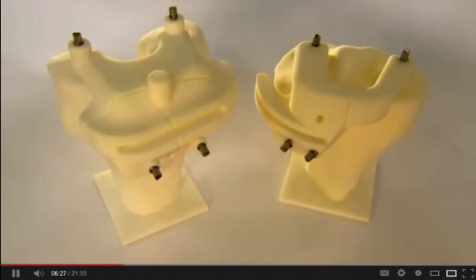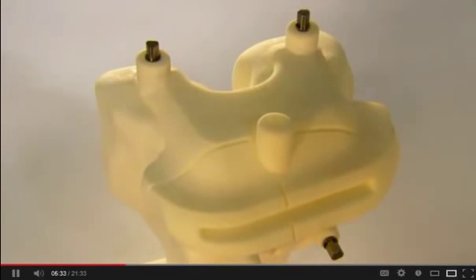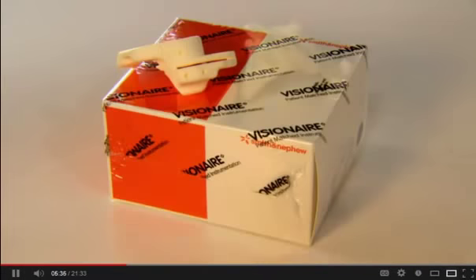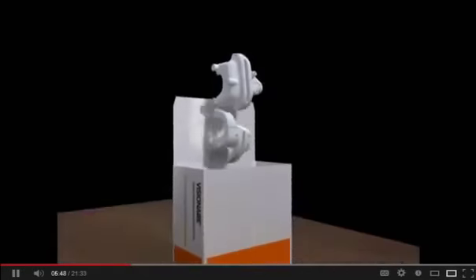This method eliminates several steps required in standard surgery. The operation takes less time and requires half as many instruments to set up and clean up. And because the surgeon no longer has to drill a hole in the bone to check the knee implant's alignment, the patient experiences less pain and bleeding, and a smaller chance of developing complications.